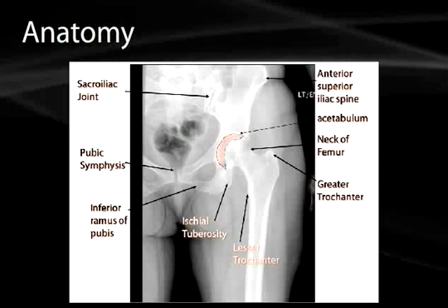Here we can see an AP view of the pelvis where you can pick up the anterior superior iliac spine and the lucency related to the sacroiliac joint. Oftentimes you'll see C-shaped sacroiliac joints because of the disposition between the posterior and lateral components. The anterior sacroiliac joint tends to be more lucent and more lateral than the posterior.